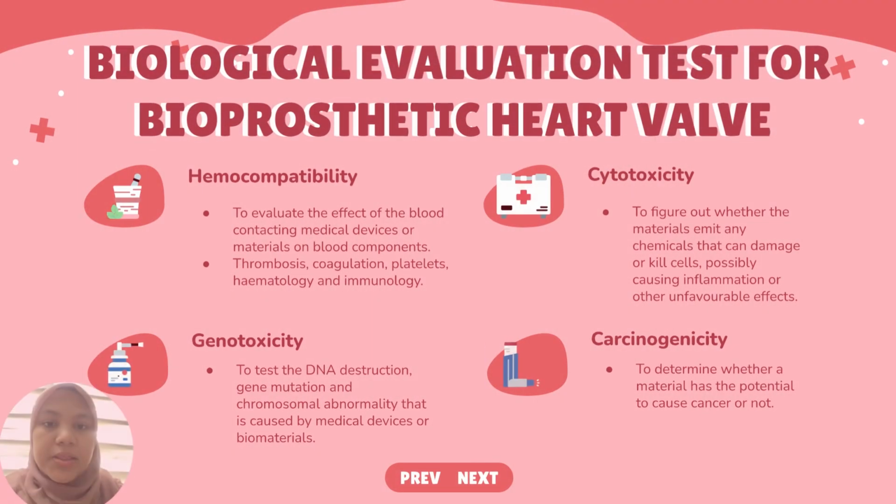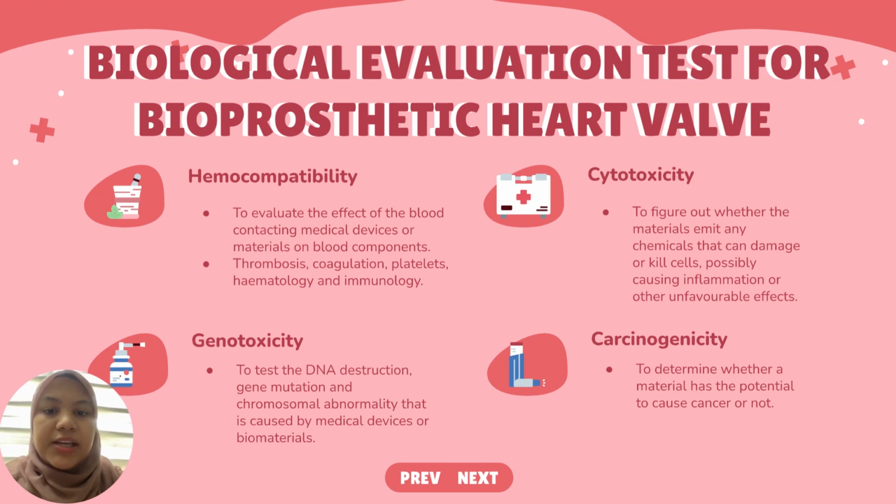Number 9 is hemocompatibility. It's to evaluate the effect of the blood-contacting medical devices or materials on blood component. This involves thrombosis, coagulation, platelets, hematology, and immunology.